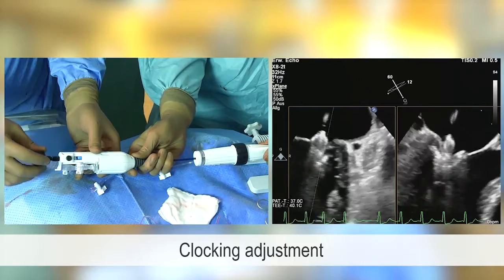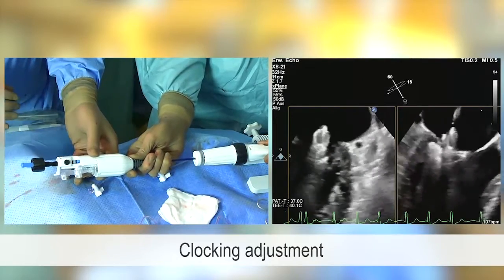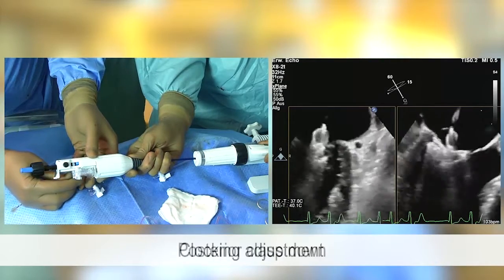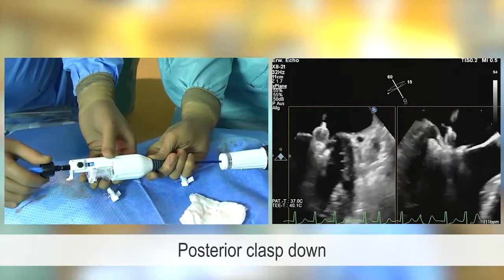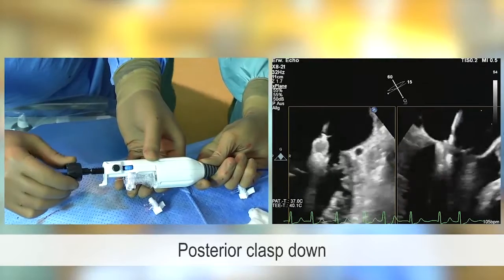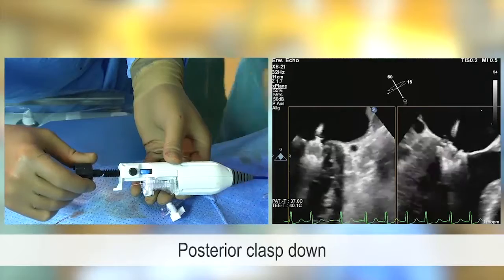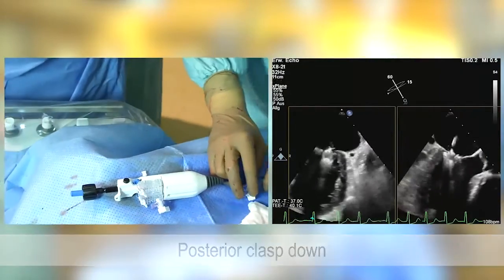The clocking is adjusted. The device is moved even further into the posterior leaflet. And when we bring down the clasp now, you can see that the clasp is almost touching the annulus. So there is as much posterior leaflet in as possible. That was what we wanted to achieve. We close the device again, and then we optimistically watch the echo and hope that we are doing better now.